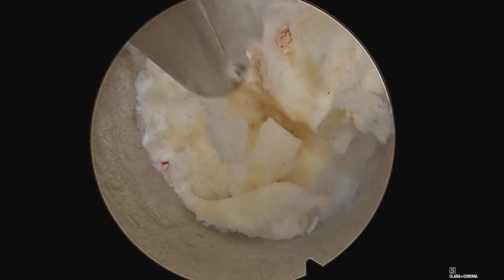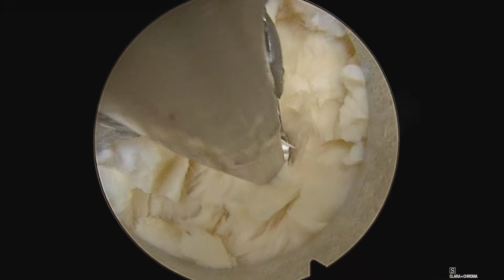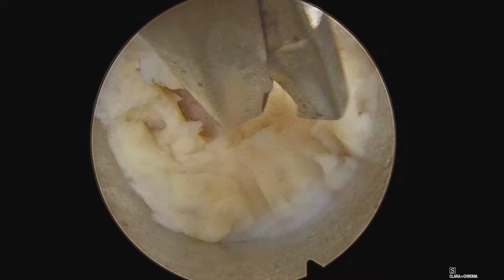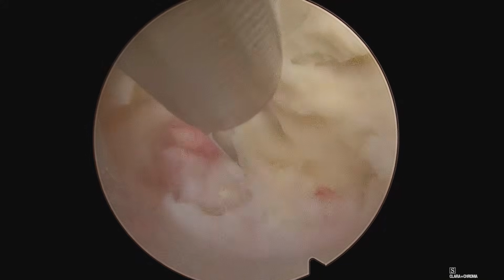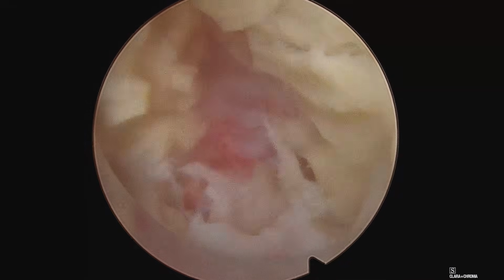Using scissors, the ligamentum flavum is gradually thinned out and cut open from medial to lateral aspect. Here, 6 o'clock is lateral and 12 o'clock is medial. Here, you can very well appreciate that the ligamentum flavum has been excised to expose the neural element. Most probably at this point of time, we think that it is an inflamed root.